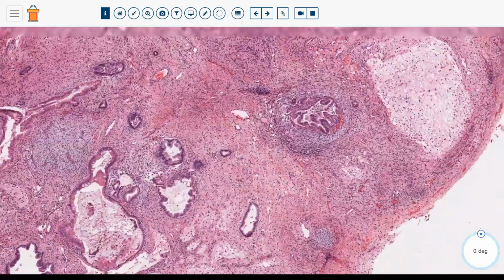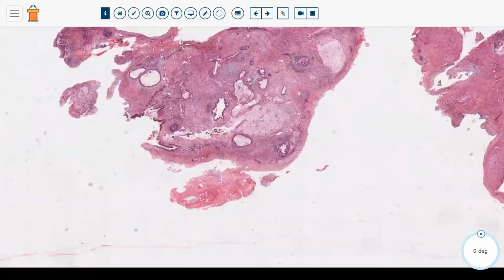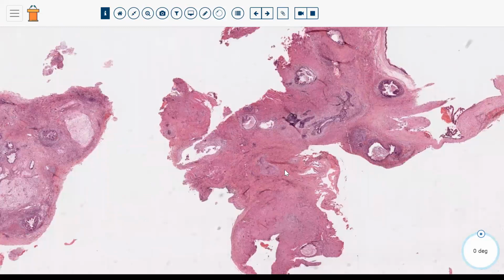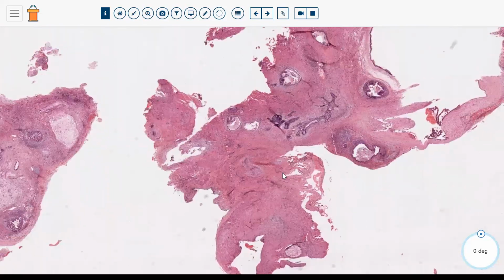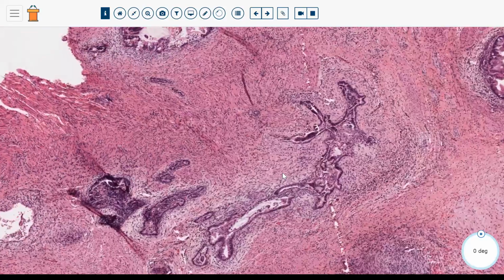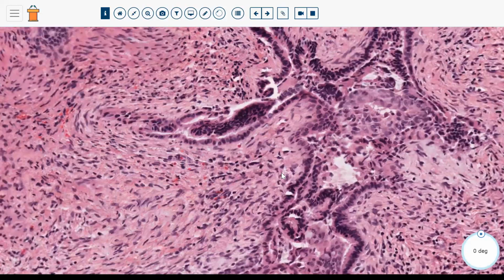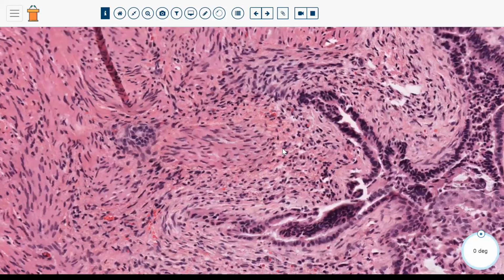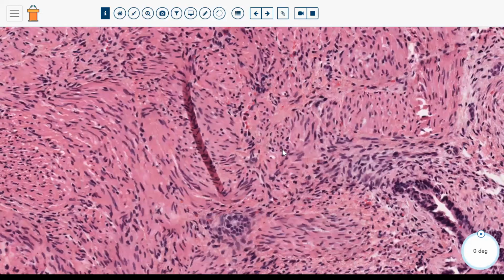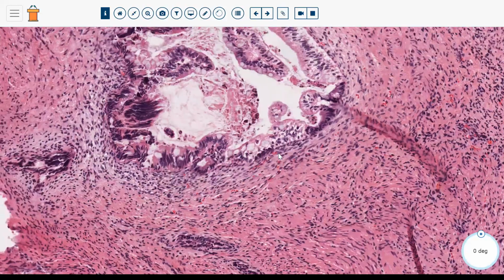And so when we talk about, again, the prepubertal versus postpubertal types of testicular germ cell tumors, it's important to remember that everything in the postpubertal group of tumors is considered inherently malignant. These are, again, derived from the GCNIS precursor. Here's a large area of smooth muscle, like I was just talking about, and some glandular structures.